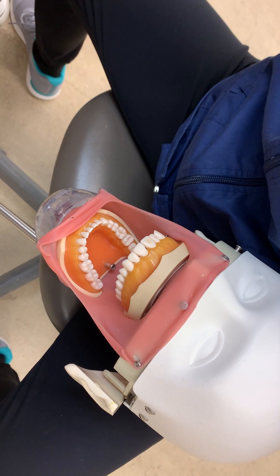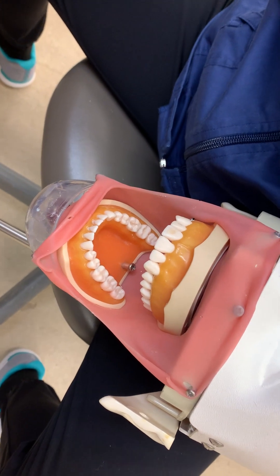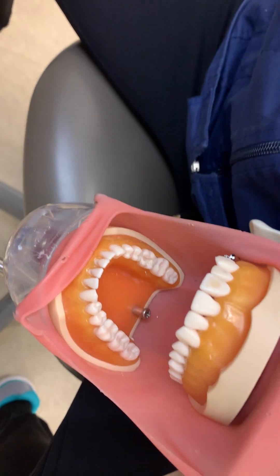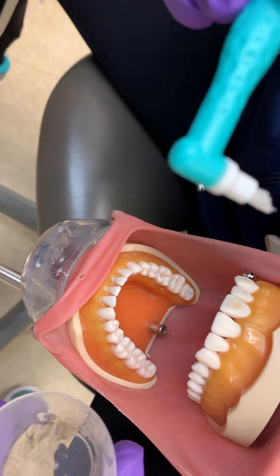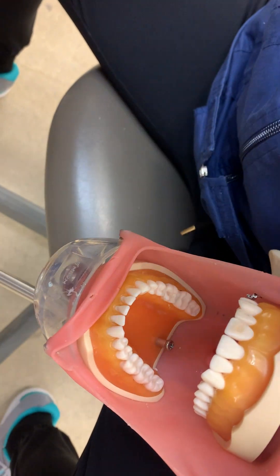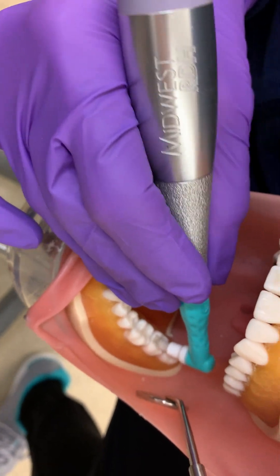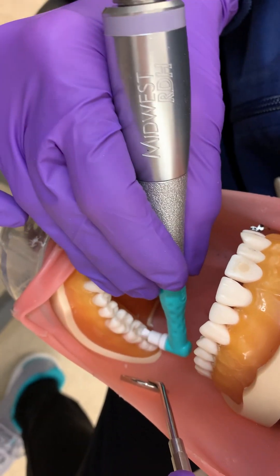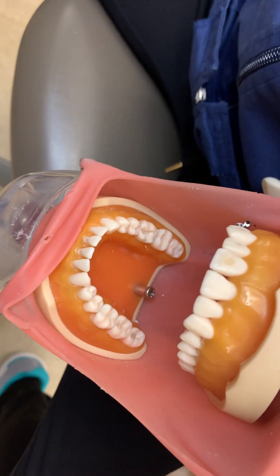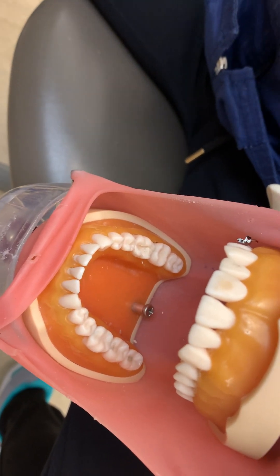We're going to apply pit and fissure sealants when not using a rubber dam. We're going to polish the occlusal surfaces of the selected teeth with a non-oily, non-fluoridated paste. As you can see, Monica is using a brush end on her prophy angle in order to get into those deep pits and fissures. We are going to flush and evacuate the oral cavity using the high-volume suction.